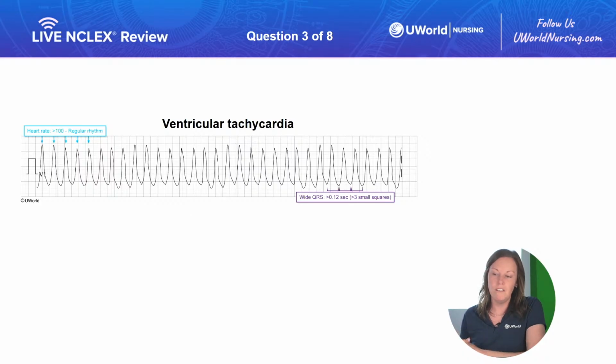But again, we need to be able to identify VTAC. VTAC can lead to VFib, and we know we need to defib VFib. VFib is a life-threatening dysrhythmia, so we need to intervene on VTAC before it progresses to VFib. So good work on that one, guys.